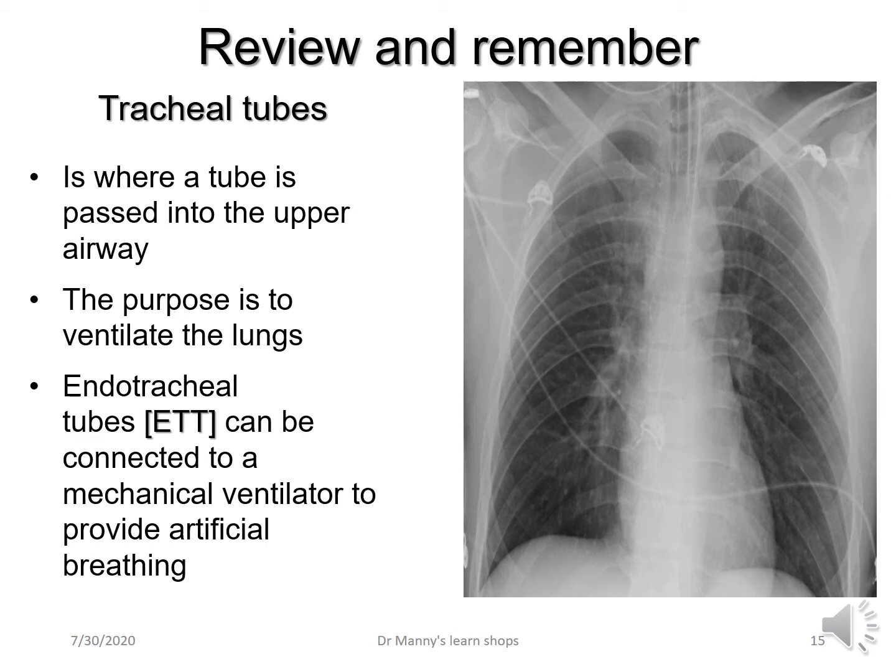An endotracheal tube is also radio-opaque. All invasive lines that are placed into the body are radio-opaque. They can be seen on a chest X-ray.